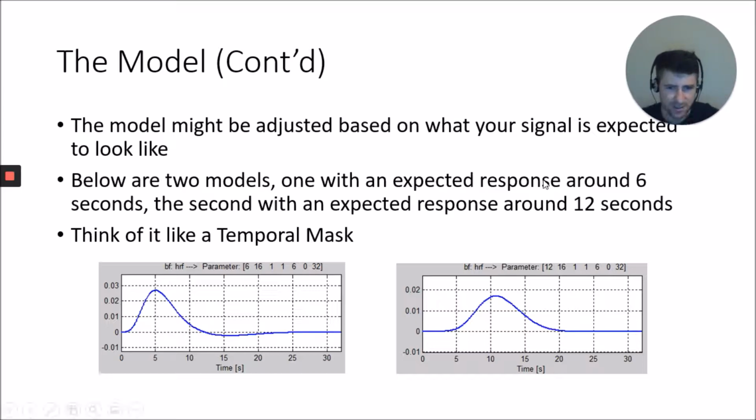And you'll notice it starts from over here, we're at 1 or 2 seconds, up to about 11 seconds. This is kind of my area of activation I'm interested in. Over here, we have 6 seconds all the way up to about 17 seconds. That's my area of interest I have over here.